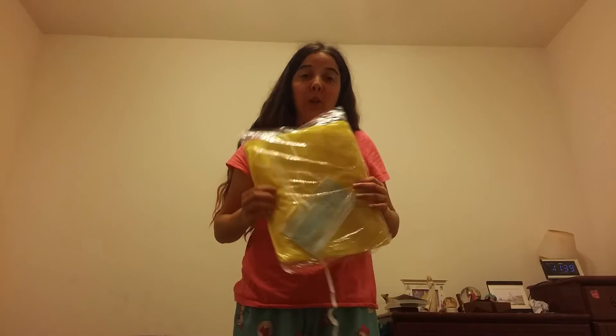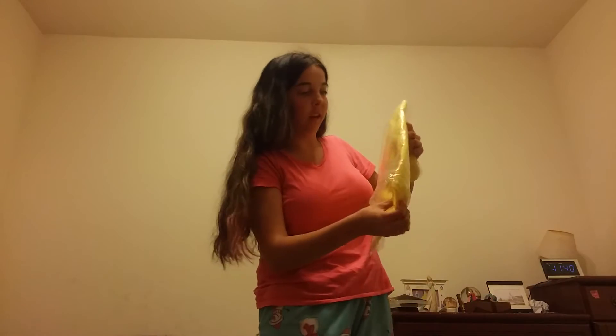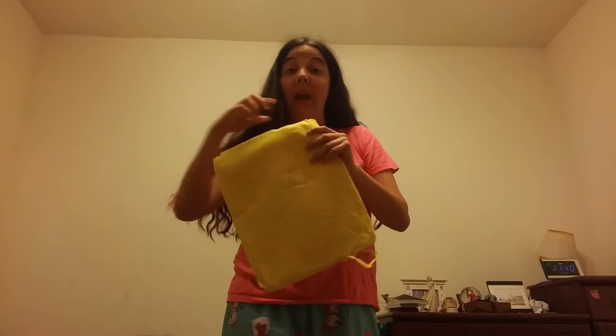Hi, I'm Deneen and I'm going to be showing you how to put on some PPE equipment. What I have here is a mask and a yellow robe, and you will also need gloves, but I don't have any of those.